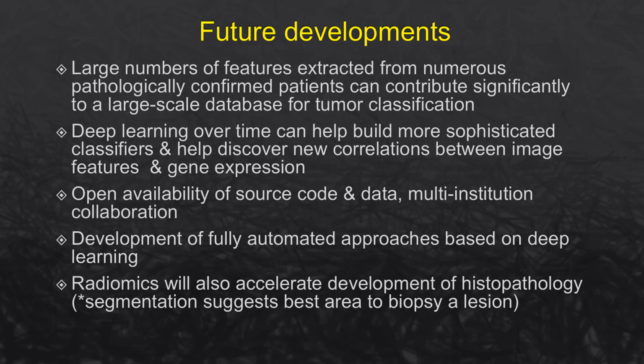Radiomics, I believe, will also accelerate development of histopathology because segmentation and radiogenomics can suggest the best area to biopsy a lesion.